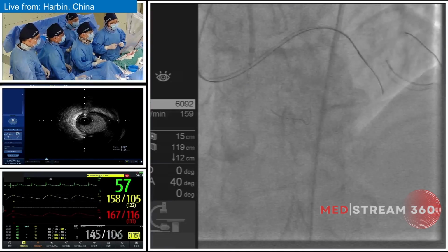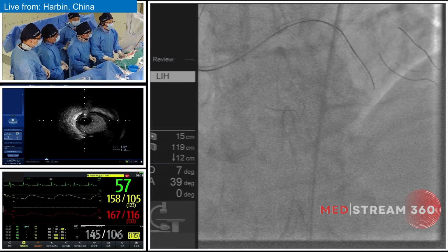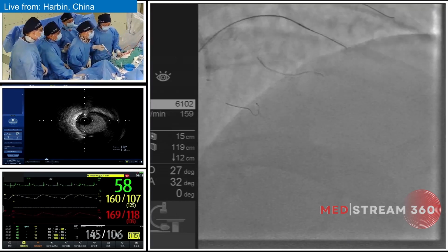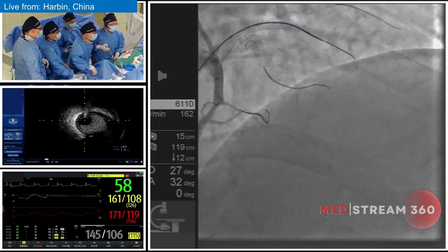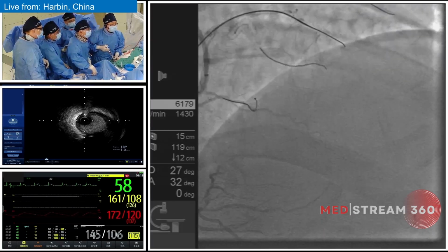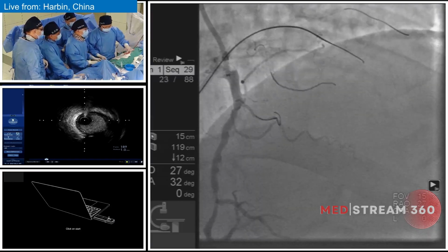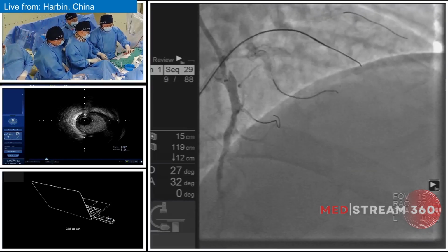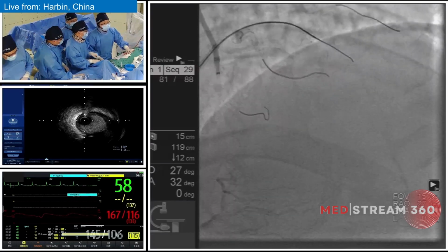When we mention the so-called important septal branch, we usually mean that this septal branch is perfusing over 10% of the left ventricular myocardium, and we can also judge from the length and the diameter of the septal branch. Majority of the times, when the septal branch diameter is less than 2 millimeter and the length is less than 60 millimeter, I think that is relatively small and doesn't cause very severe damage during the crossover and loss of the septal branch.